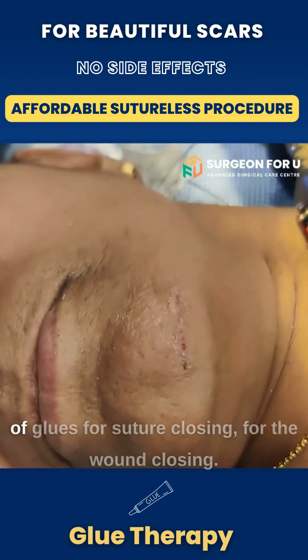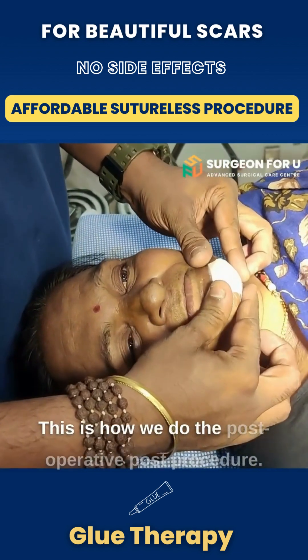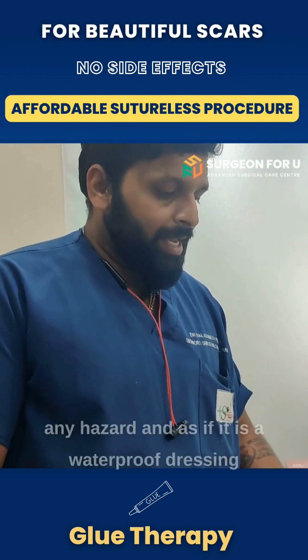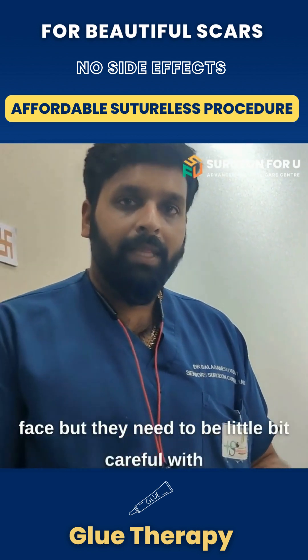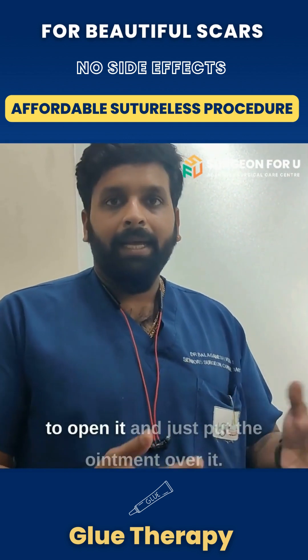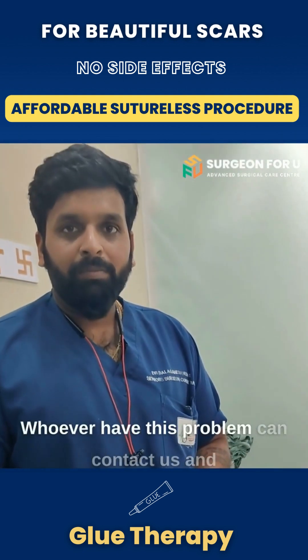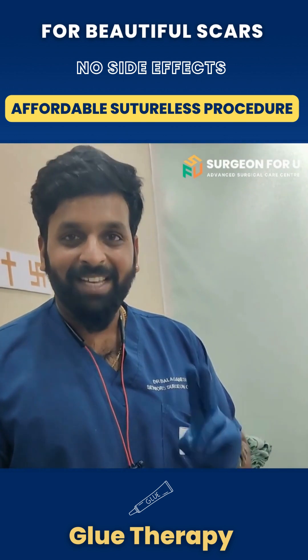We sincerely suggest this type of glue for suture closing. For wound closing, this is how we do the post-operative, post-procedure care. We will be putting a waterproof dressing so that the patient can comfortably do her work after the procedure also, without any hassle. Since it is a waterproof dressing, they can take a bath and wash the face, but they need to be a little careful that the dressing should not peel off. After three days of this procedure, we expect the patient to open it and put ointment over there. We will be posting the fifth day and tenth day photos of this patient. Whoever has this problem can contact us and come forward to our OPD and get this treatment done at a very affordable price. This is Dr. Bhalkanesh signing off. Bye.